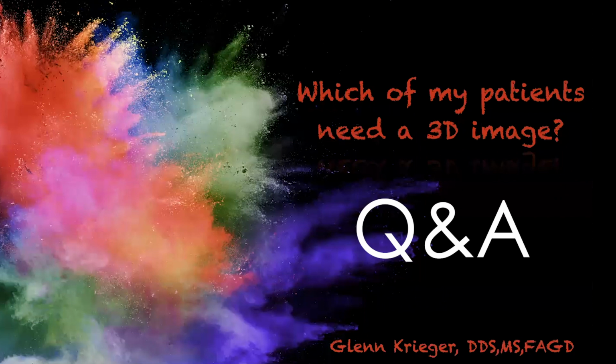For a pedo, I think it's 16 by 13 centimeters with a 0.3 voxel size. That's what my typical scan is for what we call a low radiation one. The adult one is 3.7 seconds, and I think the pedo one is 2 seconds. Also a 13 by 16, I think it is. I apologize, the technical specs are not my thing, but I think that's the rough ballpark. It's 0.3.